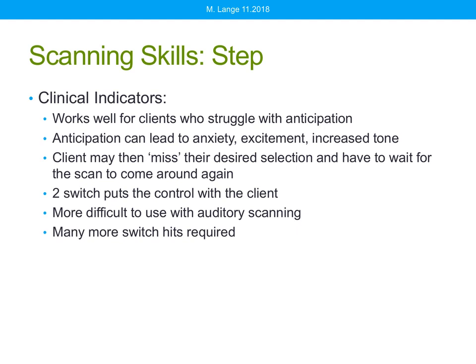So when is step scanning indicated? Well, again, this works well for clients who struggle with anticipation. That anticipation leads to that anxiety, that excitement, the increased tone, and then the client often misses their desired selection that they work so hard to get to, and then they have to wait for the scan to come around again. Two-switch puts that control firmly with the client. They can choose to move through with their moving switch, that first switch, at their own pace as they wish to. But it can be more difficult to use with people who use auditory scanning. And again, there are a lot more switch hits that are required.